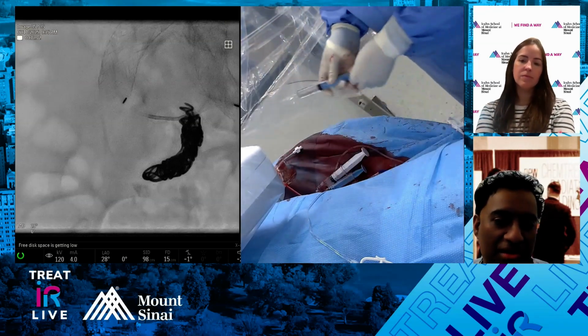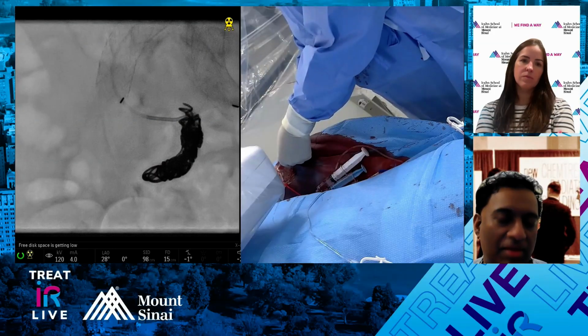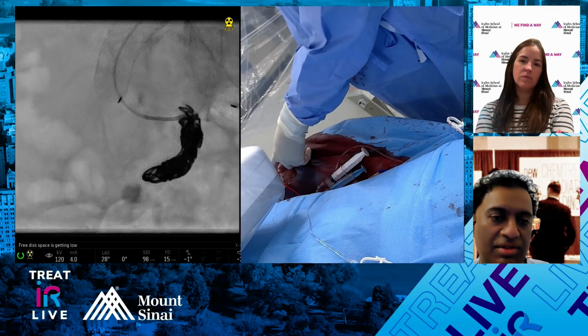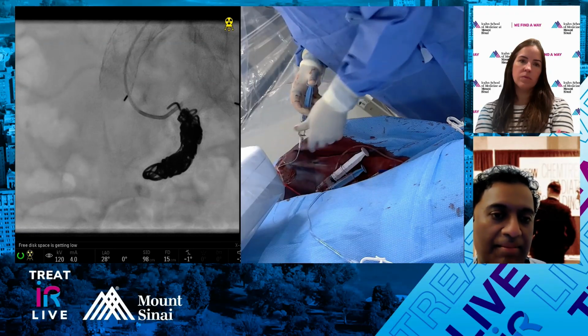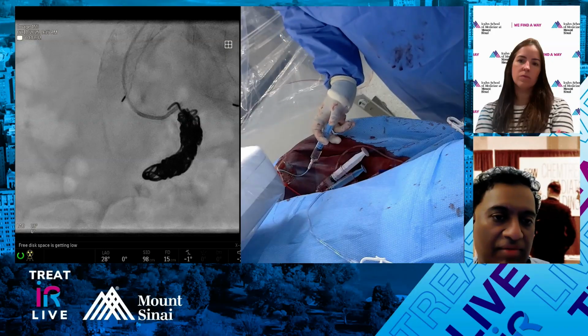One thing you could do, say in this case, right? Say you wanted to go ipsilateral femoral, right? I mean, radial would be a little tricky. You could put an RTP sheath and try to plug. Most of the stents that we use in this area are going to be like a Gore limb. Minimum diameter is usually 12 French. So that way you'd have to go from transfemoral.